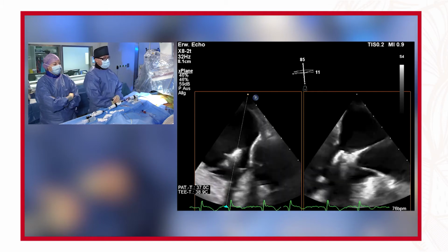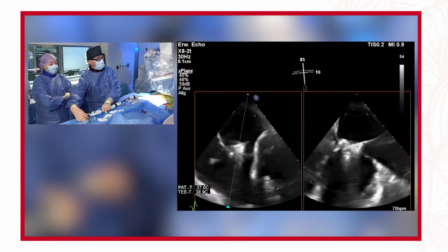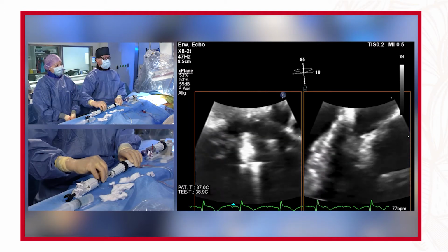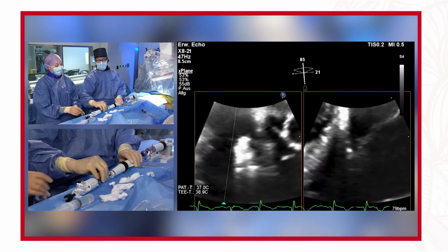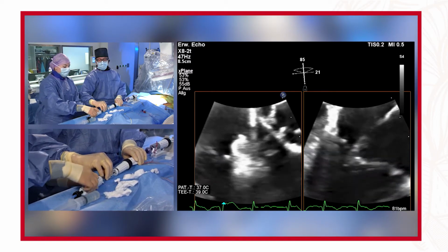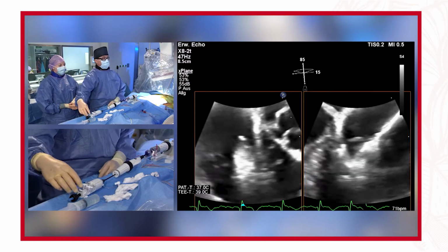So this is the reason why we're going to try to do an optimization procedure, meaning that we're reopening the PASCAL system, swinging again over to the septal leaflet, opening the clasp, and when the leaflet is nicely in, we are reclosing the clasp so that we have a maximum of the septal leaflet in the device. You can appreciate here that there is a deep leaflet insertion. I'm closing the device in a few seconds.